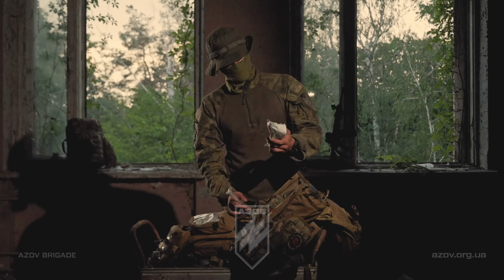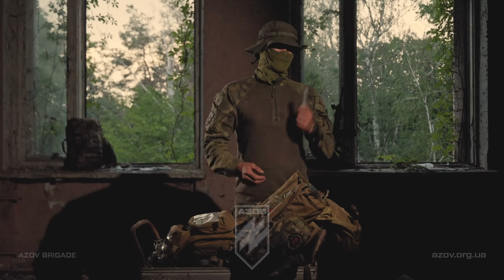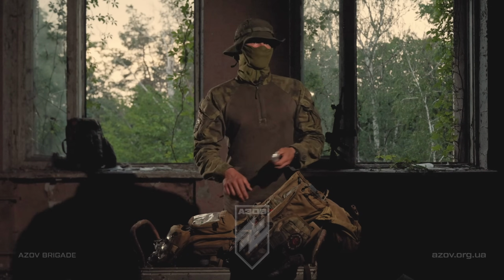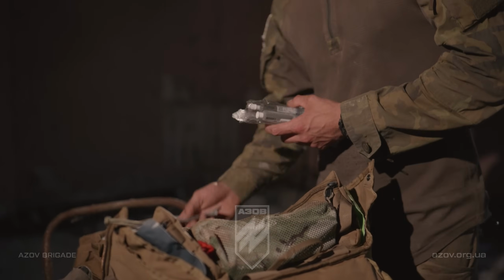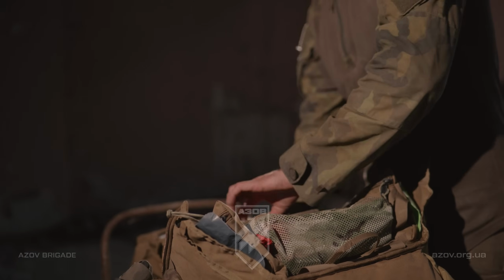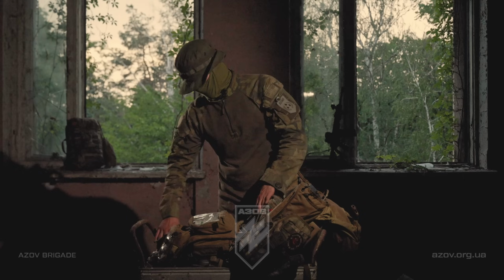I have a third kit made up as well. Just easily accessible, so if I'm in the dark or anything, I can just grab one kit, put my torch on my helmet, and then I can just get the IV in instead of scrambling for multiple parts in the bag. I then carry some spare saline flushes in this pouch and some wipes, basically antibacterial wipes, antiseptic wipes, anything to clean the site where I'm going to be placing the IV, because I'm trying to minimise infections.